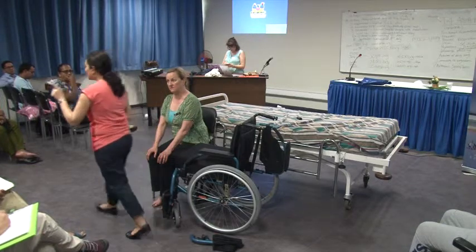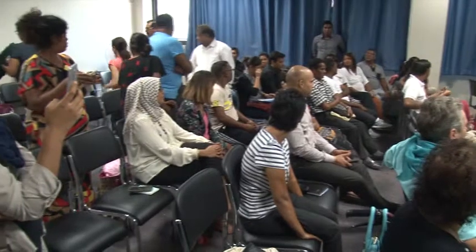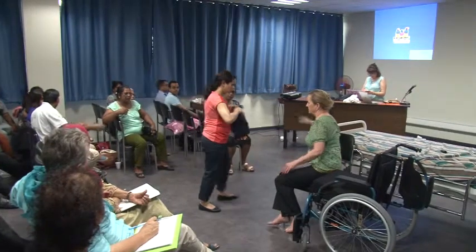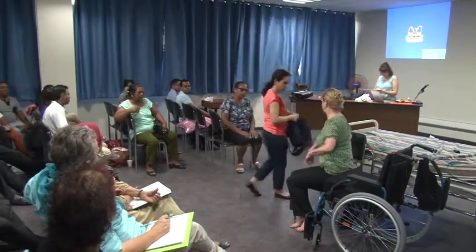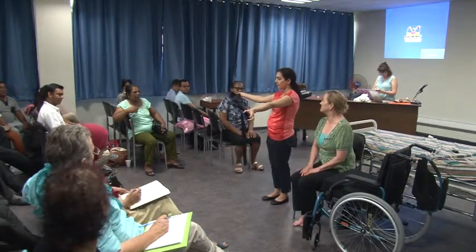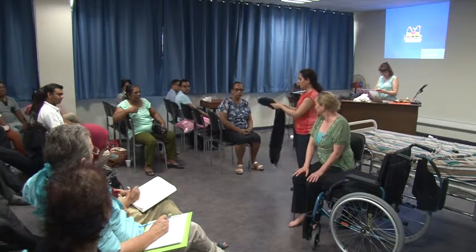Okay, so we've got something called a handling belt. Have you come across that? Some of you have. I'm not sure which one it is, that one or that one. Okay, so again, this is a handling belt, and it helps us to have a good grip on the person. So you're not pulling their clothes, you're not pulling their arms, right? You have a good grip because you've got these to hold, right?